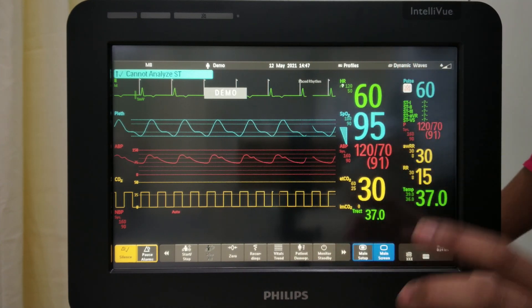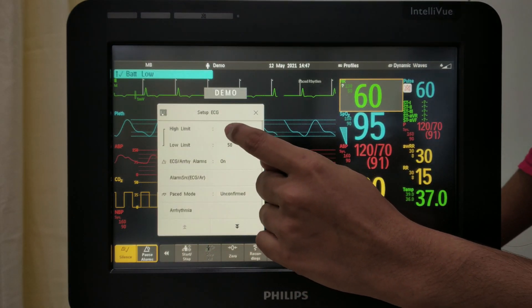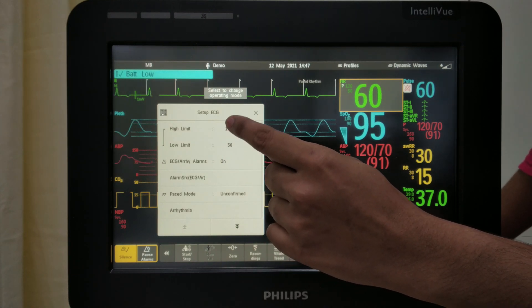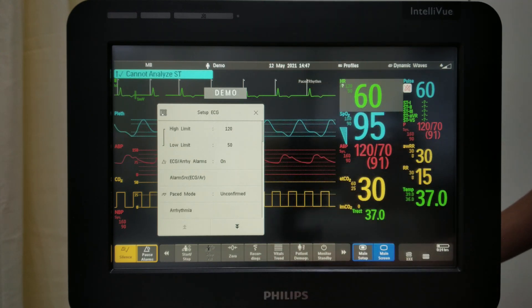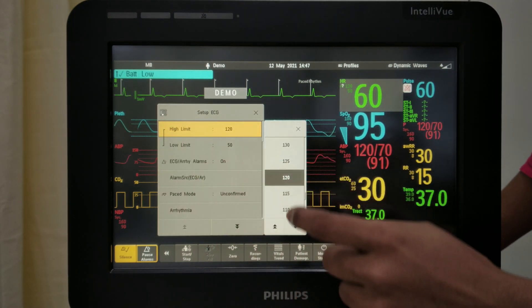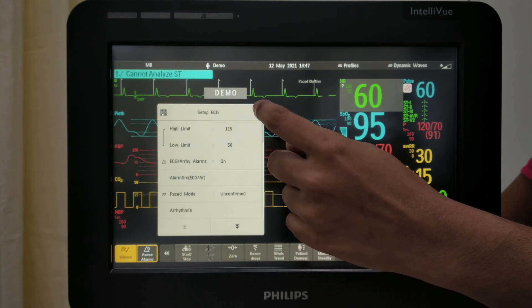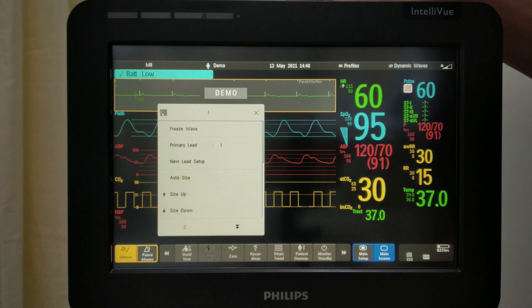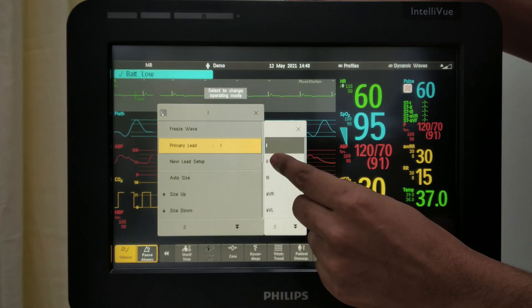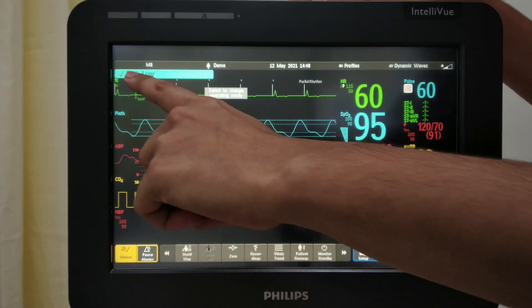These are the waveforms. If you want to change the upper and lower limit of any parameter, you can change it from here. This is the upper limit and this is the lower limit. If your patient's parameter goes above 120, it will give an alarm. Or if it goes below the lower limit, it will give an alarm. You can change these values here. You can also change the lead — for example, from lead 1 to lead 3.